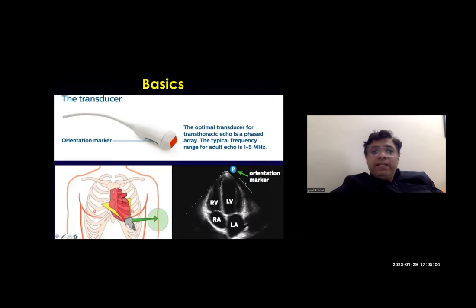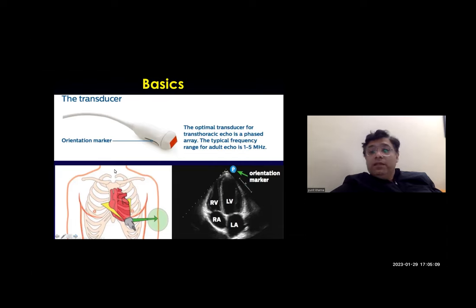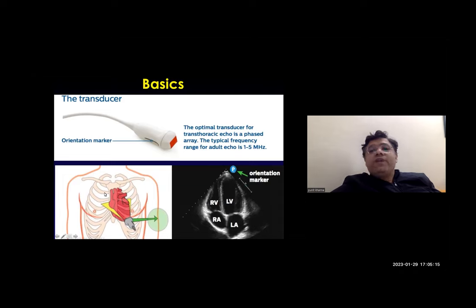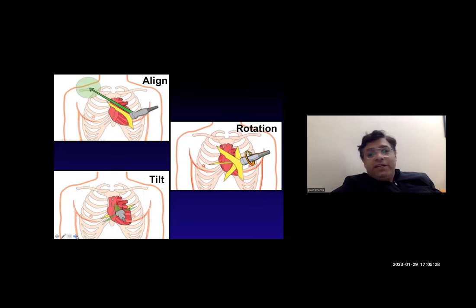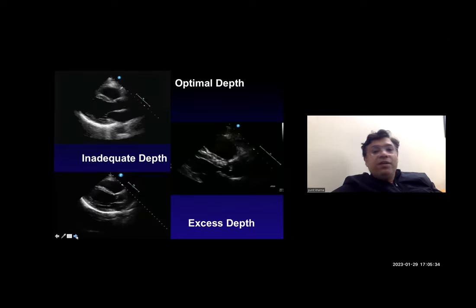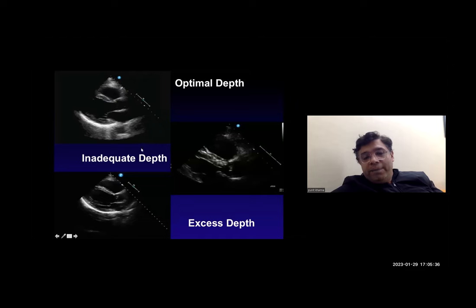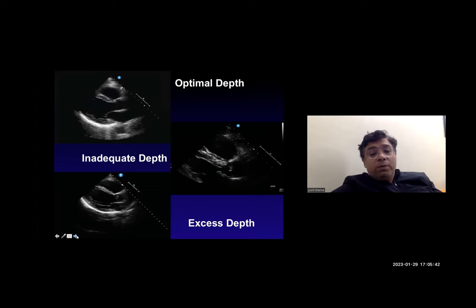The optimal transducer for a transthoracic echo is a phased array probe. The typical frequency of an adult echo probe is 1 to 5 megahertz. When using the probe, you have to align it, rotate it, and tilt it to get a correct, appropriate, and definitive picture. Optimal depth is required for obtaining a good picture — inadequate depth and excess depth both need to be avoided.